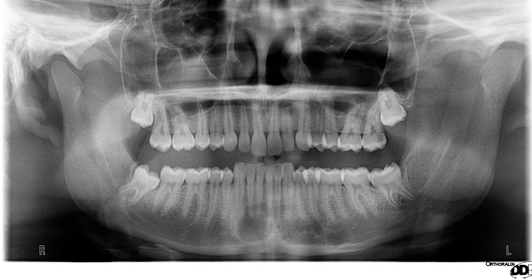Also, the reason this image was referred to me is due to this radiographic appearance in the anterior mandible. The inferior half of this radiolucency appears to be somehow corticated, whereas the superior half of the border is not as well corticated and it's somewhat ill-defined.